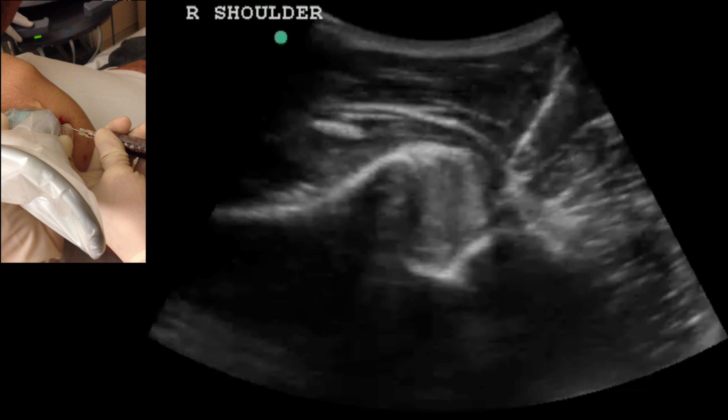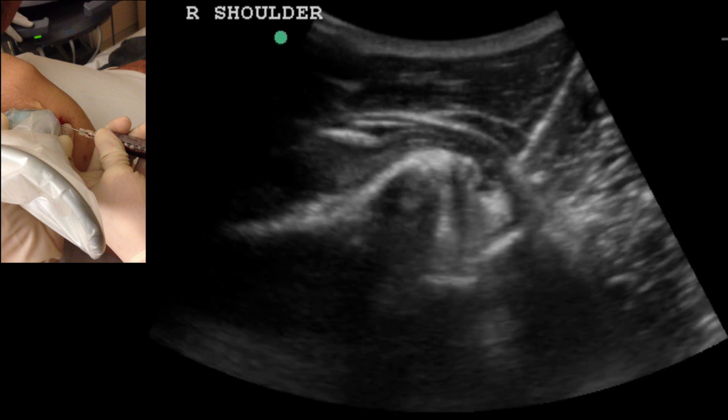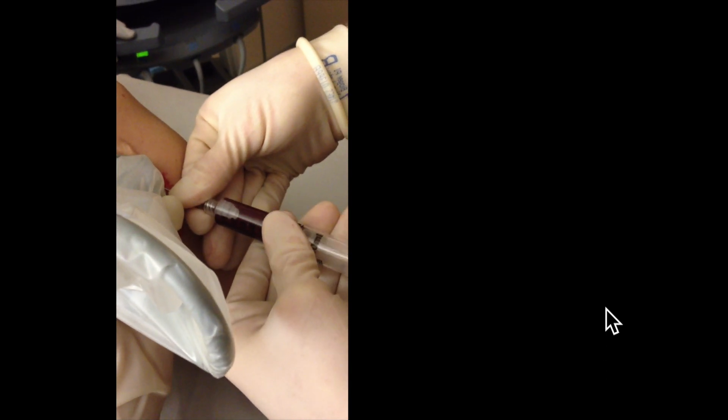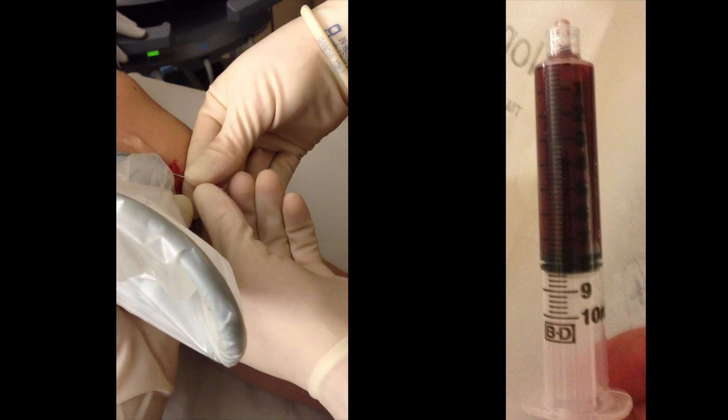Essentially what we're going to do is take that needle — here's our needle coming in, here's our humeral head, and here's our hemoarthrosis — and we're going to see that needle in the hemoarthrosis and aspirate it. You can see it getting a little smaller in that short video and even smaller in the subsequent clip. I usually like a 10 cc syringe, which will typically be enough. Provide a little suction on it; don't get overly aggressive as it gets smaller, as it may suck up to the joint capsule.